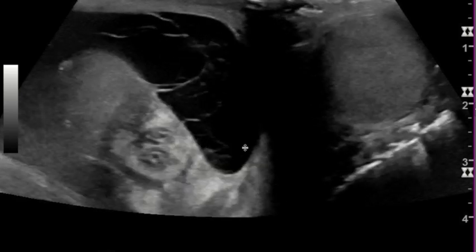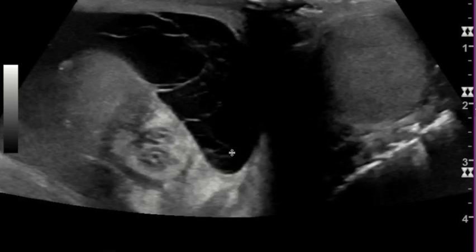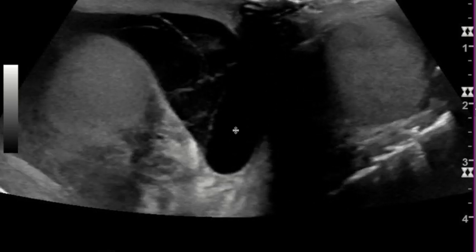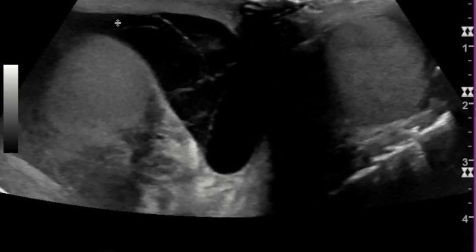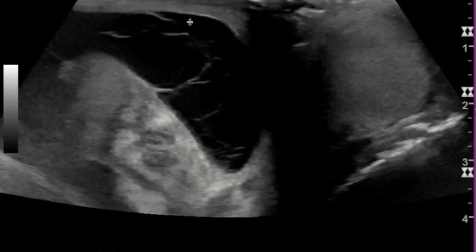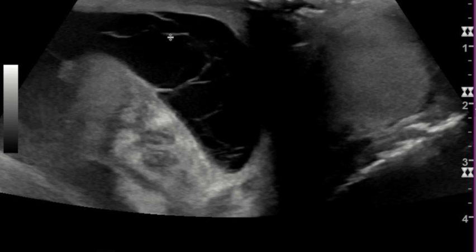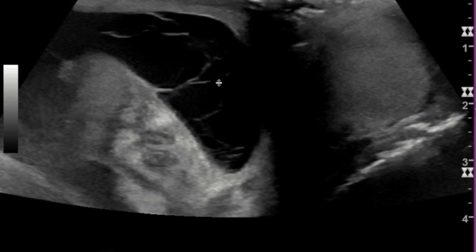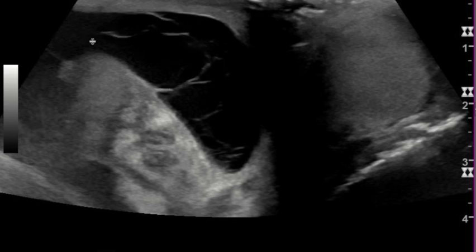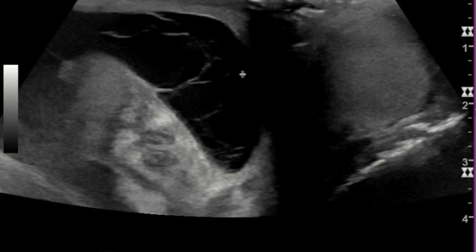We see that there's this hydroseal or fluid collection around the testicle, which has these septations within it. Hopefully you can appreciate these septations, almost like cobwebs, within this anechoic or black fluid collection.